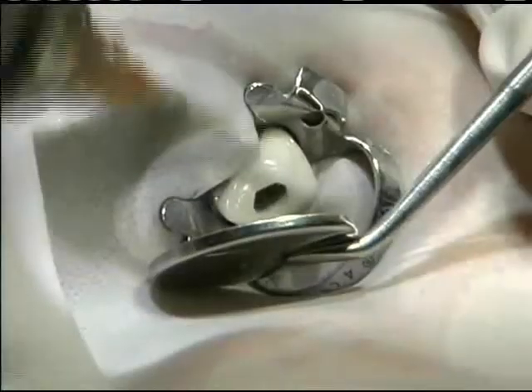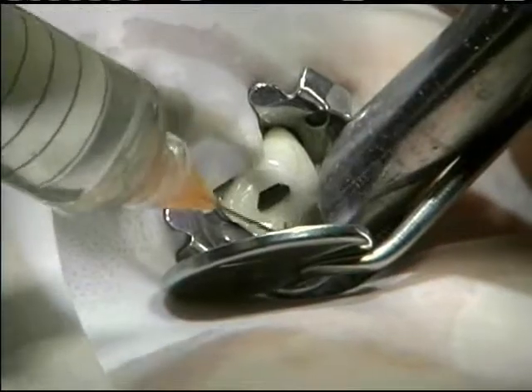Small hand files and chelating agents may be needed for the most intricate apical anatomy.